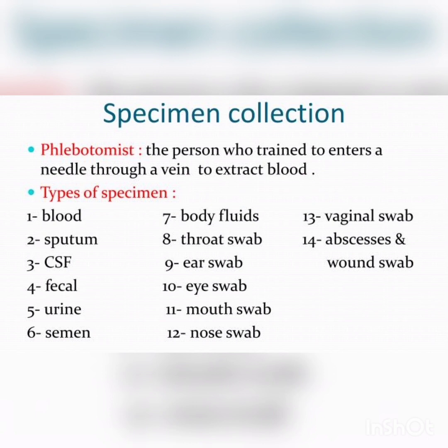And the swab which is inoculated with the material from the patient is placed in that broth tube. In that you will keep the swab which has the causative organism material. So you will dip into that broth and you will prevent the drying out.